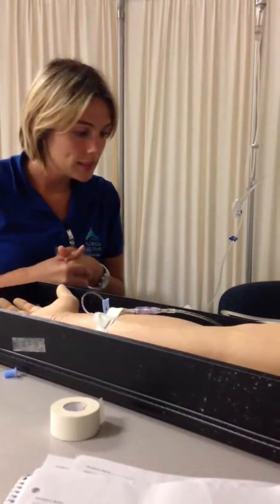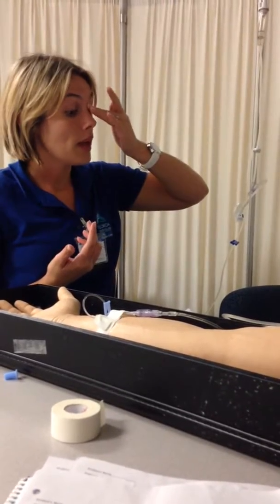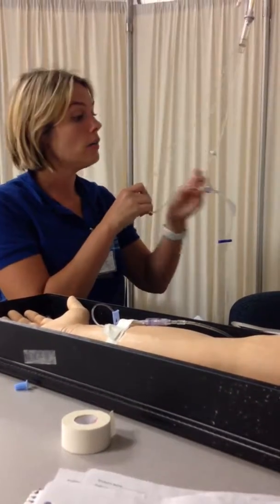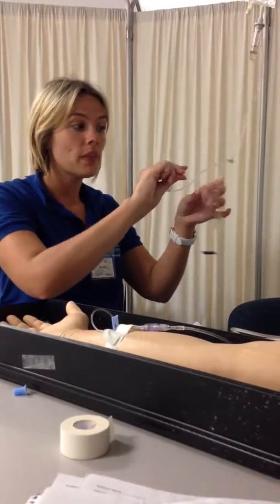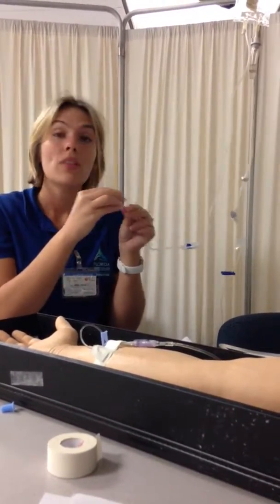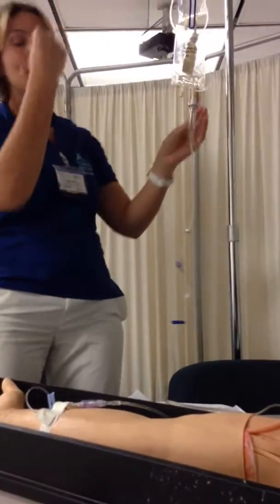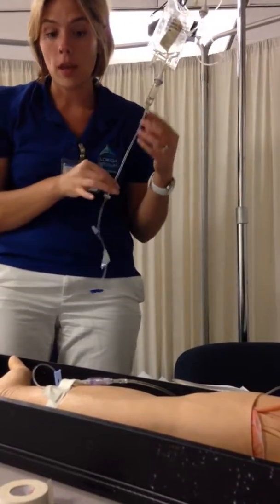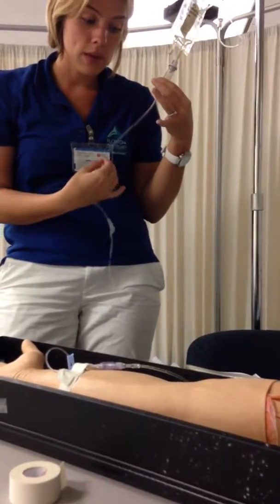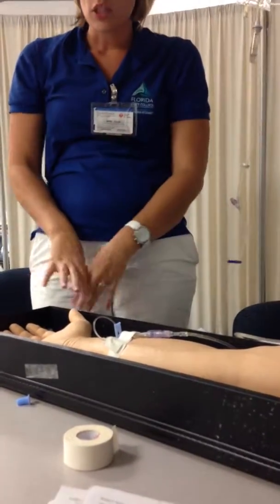Forty-five minutes has passed and I see that all my medication in my mini bag is gone. What I'm going to need to do is clamp this off and disconnect it. I'm going to put an alligator clamp on my tubing so that this can be used again. It's sterile and it can be used again, and I'm going to hang it. Now I need to set my primary tubing back to the flow rate it initially had, so I'm reestablishing its flow rate. Then I'm going to take all my needles and syringes and deposit them in the appropriate containers.